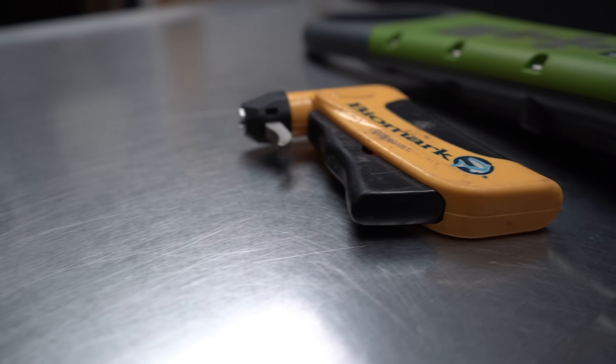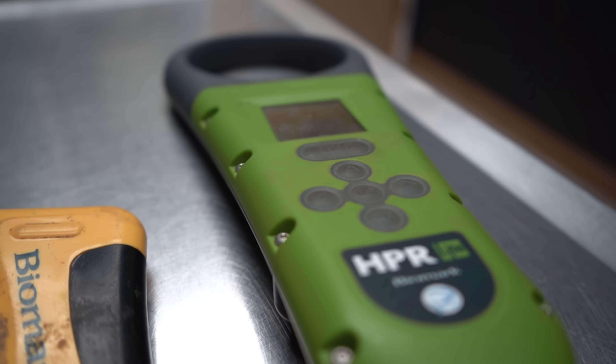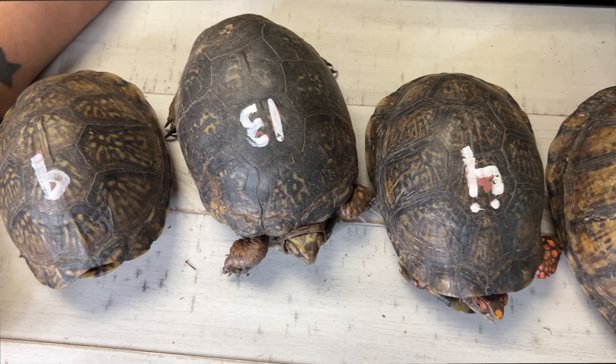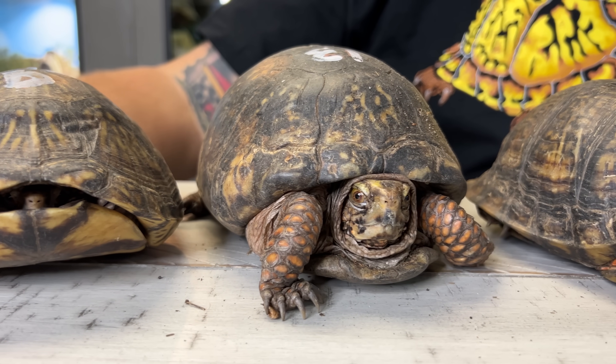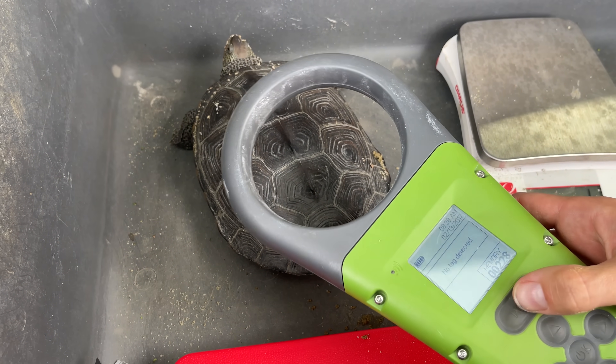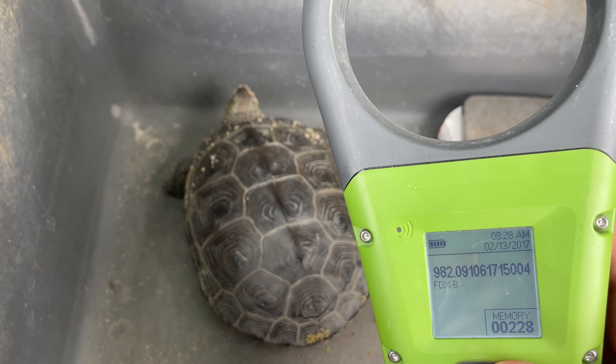It's because we are using this for a proper and permanent identification measure. There are three standard ways to do this with turtles and tortoises: you can paint the shell, you can carve something into the shell like notching the scutes, or you can use microchipping. Paint can either be toxic or come off — it's not permanent. Notching the shell can be extremely painful and if done too young it can grow out. But microchipping is internal, painless, and permanent. It's the standard, most acceptable, efficient way to properly identify tortoises for the future, and can even aid in recovering illegally poached animals and getting them back to their native lands.